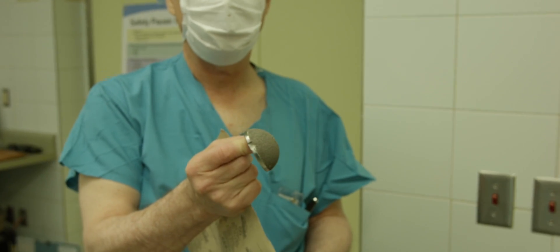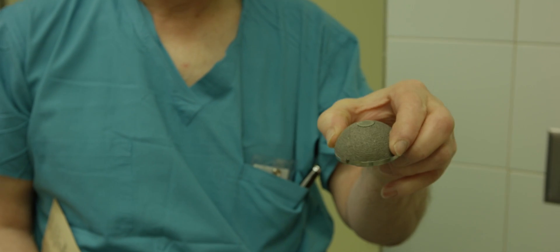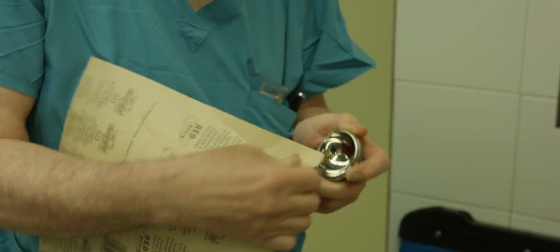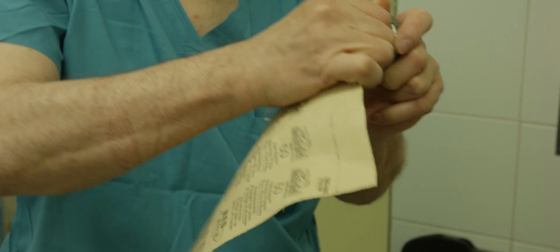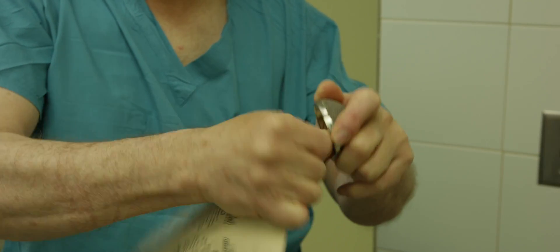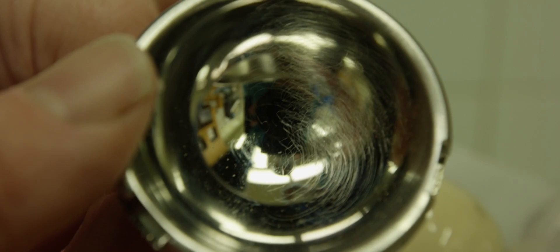The socket — an all metal socket. This one has very elaborate texture on the outside, so it'll be a little harder to see. You can see it really marks it up on the socket too.